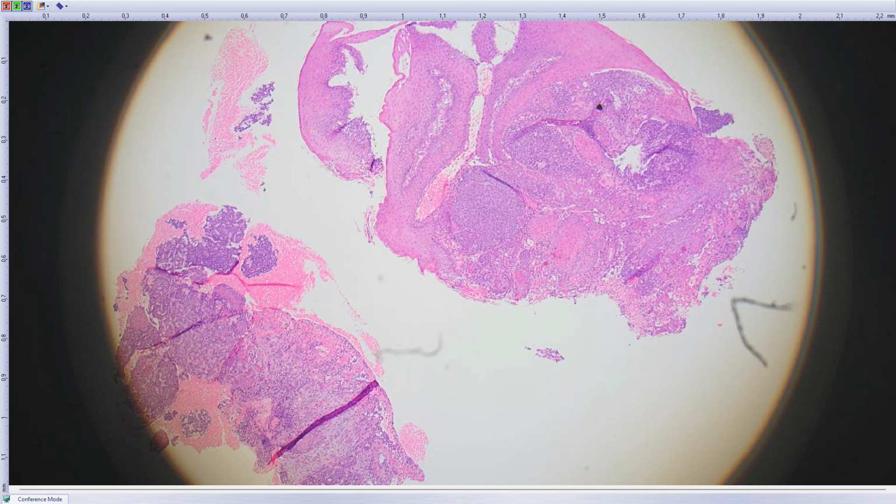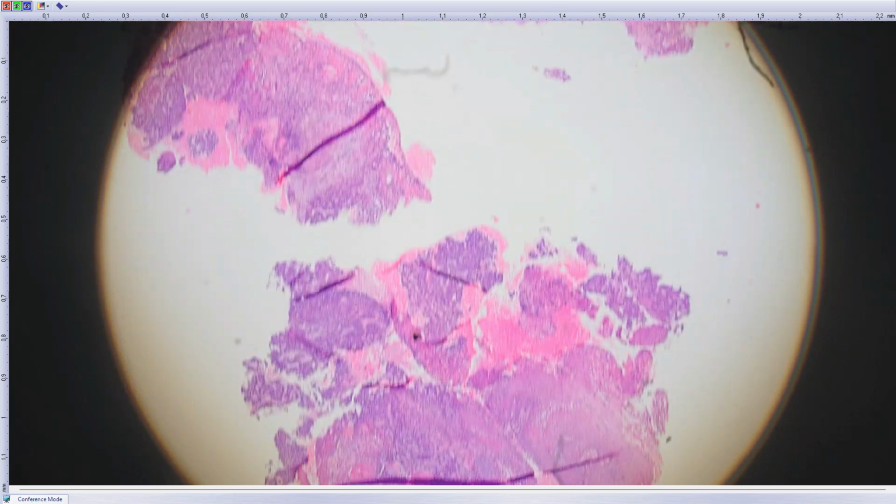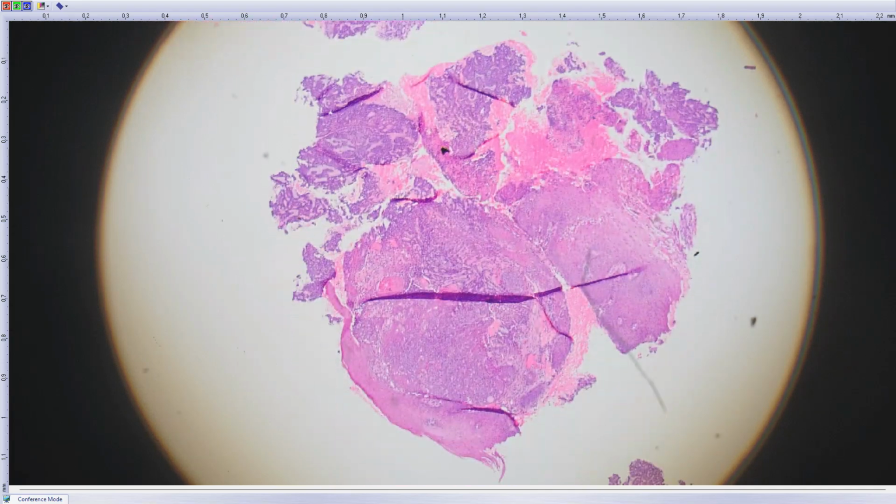This is more difficult. It's a consult case, and you can see fragments in scanning magnification. That's a probatory excision of a tumor of the oropharynx in a 58-year-old male patient, and it was sent for a second opinion from Germany.